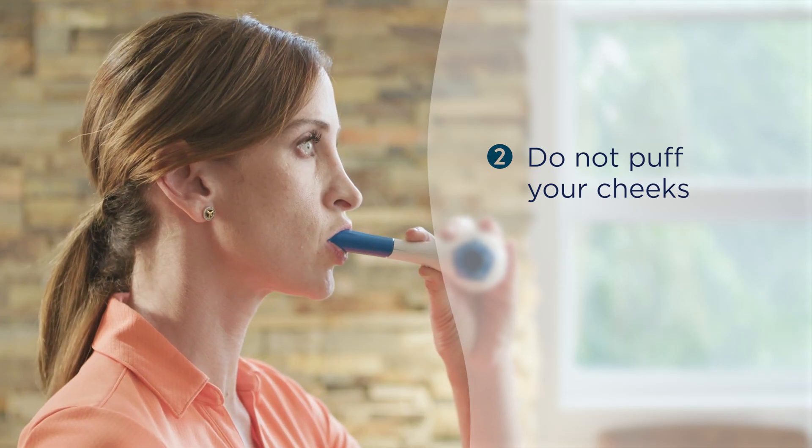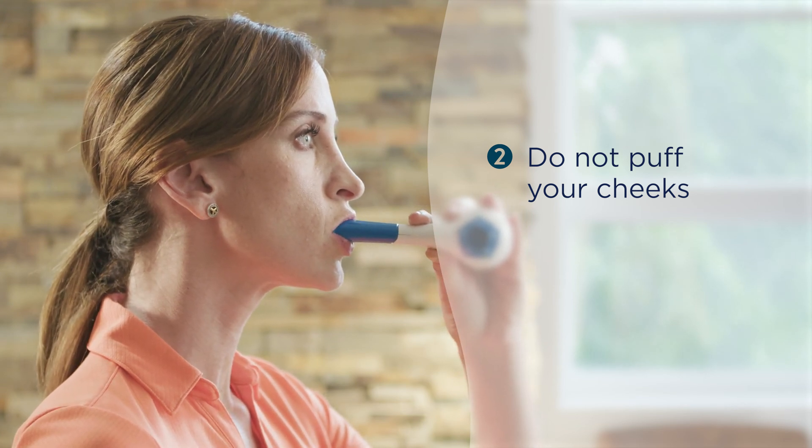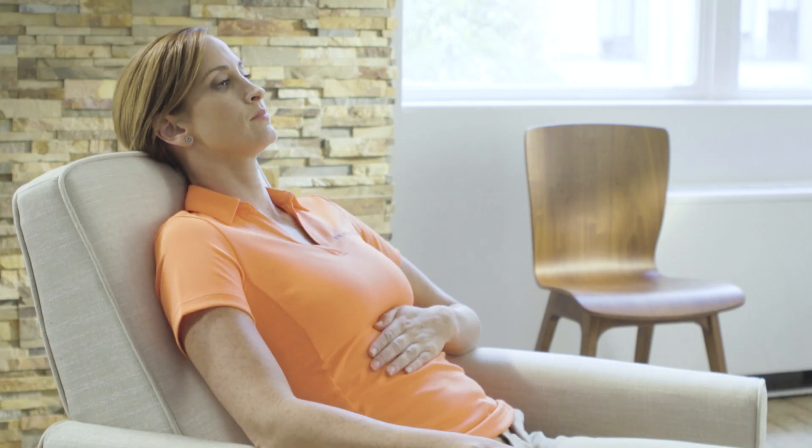Do not puff your cheeks while exhaling. Exhaled resistance should be generated from the airways, not your cheeks. If you are puffing your cheeks during exhalation, your setting may be too high. Turn the exhalation dial numbered 1 through 5 back a setting, or try resting a little longer between reps or sets. You can also hold your cheeks with your hand until you are more comfortable in training.